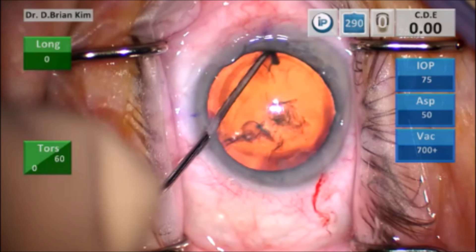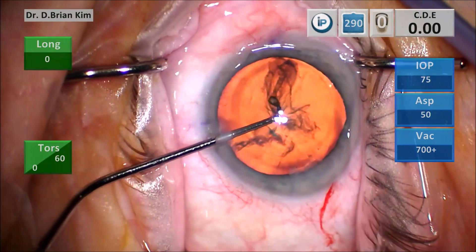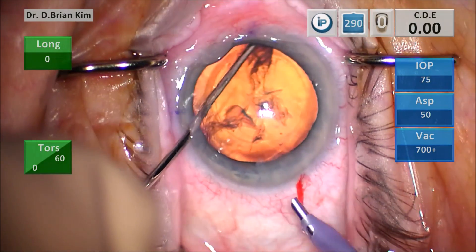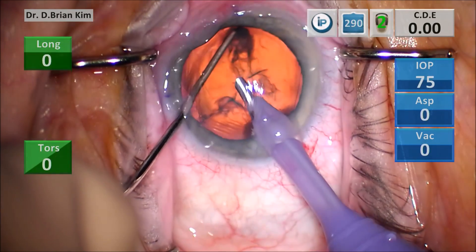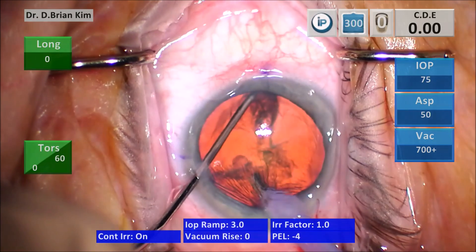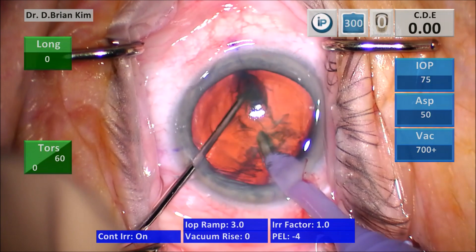This is the ready position for the chop maneuver. Going pronated and then supinated back into the equator, I'm in the ready position to initiate the chop. The phaco tip is within the anterior capsular opening and I dive down into the epinuclear material, outside of the endonucleus but at the same level.